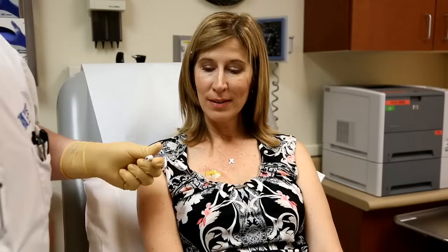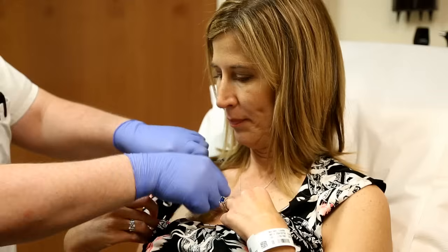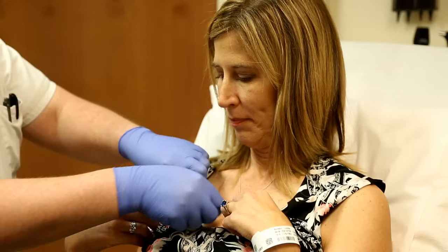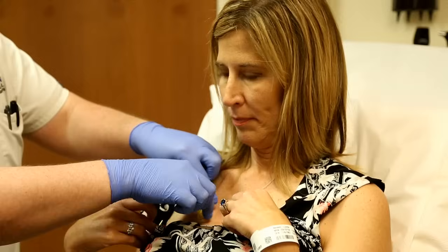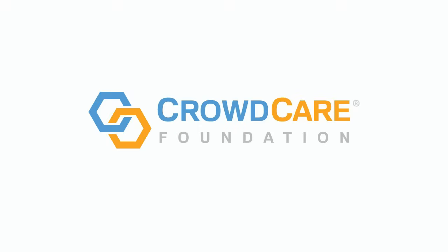Absolutely painless. The only thing I feel right now is sometimes a little bit of cold. So we'll just de-access you now and take out this little dressing — if it wants to let go of your skin. And one, two, three. All done! Thank you.